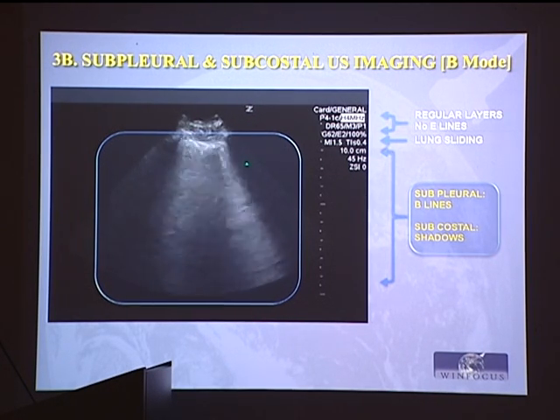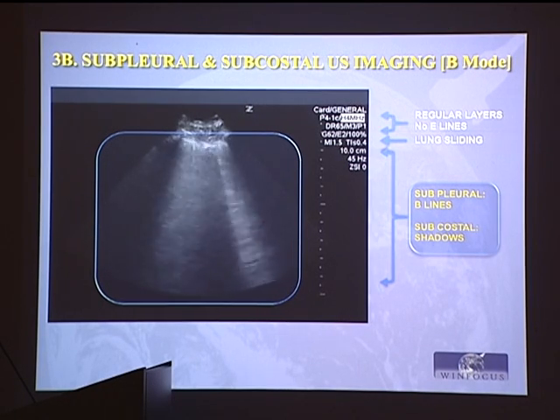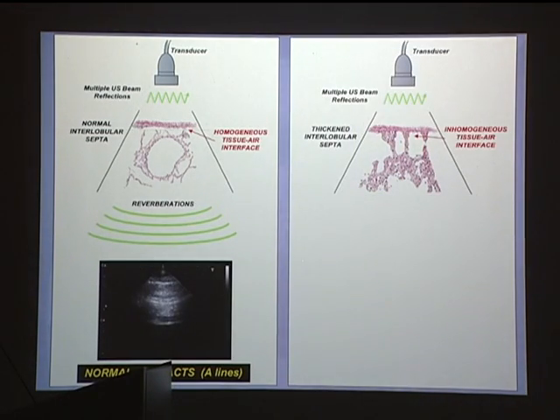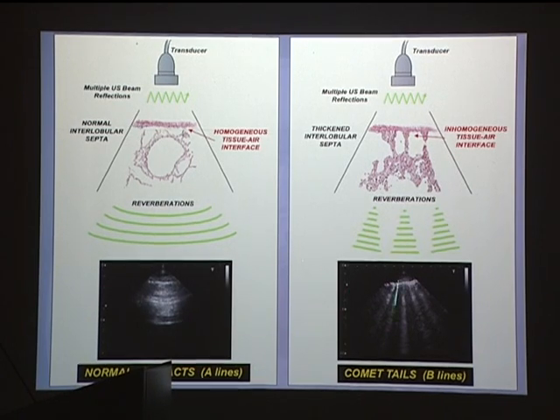No subcutaneous emphysema, lung not collapsed by free air, neither by free fluid, with wet lung or disventilated lung, according to the clinical condition. This is how the thickened septa and wet alveoli originate the vertical line instead of the horizontal line.